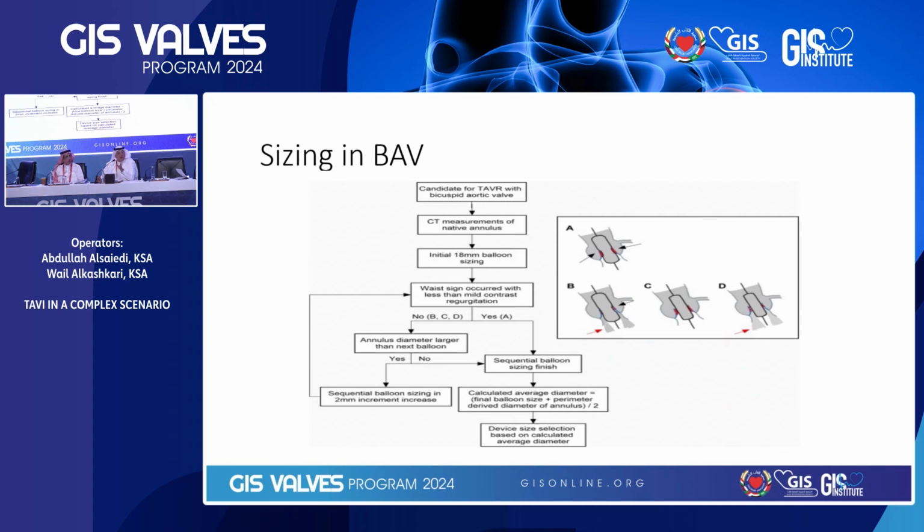I love self-expandable valve in bicuspid aortic valve. Very nice illustration, Abdullah, but I will tell you the way I do it, then we're gonna go to the case. If you are using a balloon expandable, there are two ways.